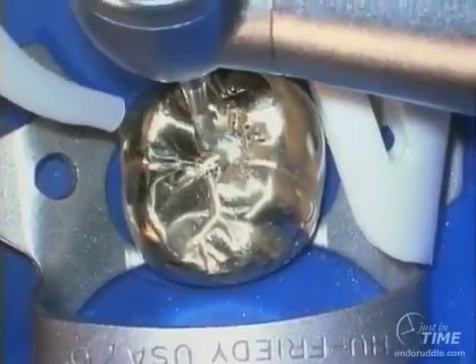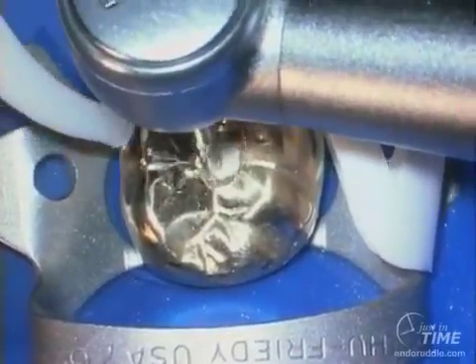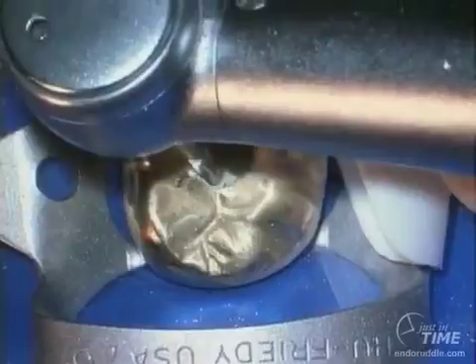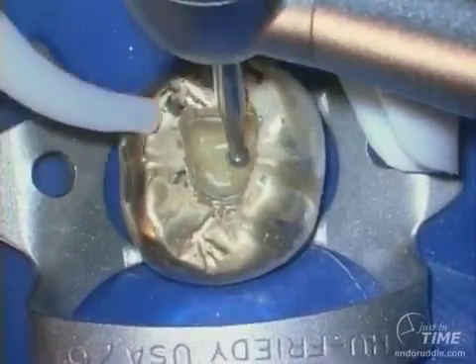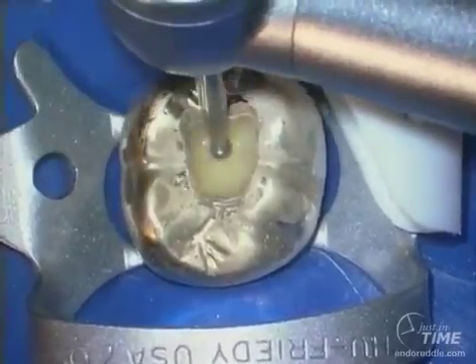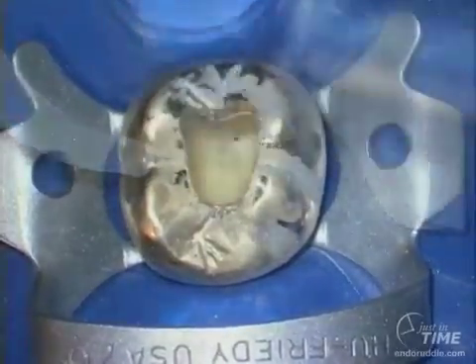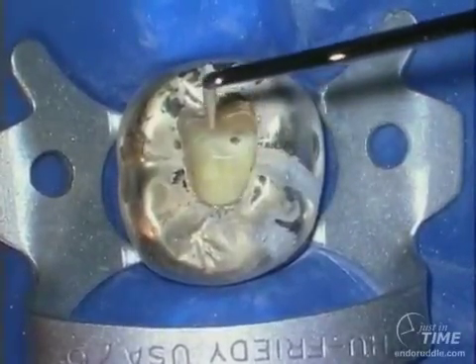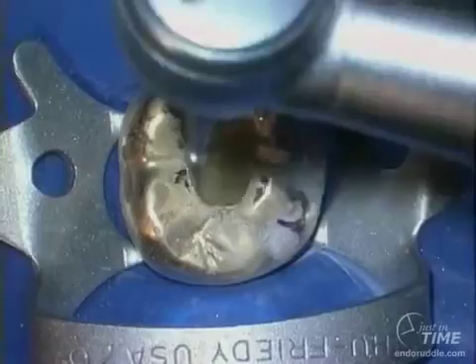Be sure to have a good finger hold because sometimes these burrs like to skip or skate when you have a metal burr on a metal restorative. You can then expand the access mesially and begin to get prepared to use surgical length instruments. A surgical length number four round burr allows us to brush in a mesial-distal direction. The assistant can blow air through the stropco to evacuate dust up the high-speed suction. We work progressively mesial and distal until we uncover a little bit of the pulpal chamber. Notice the access pattern — it's incomplete but expanding, and it will be finalized once we find the pulpal floor and the related orifices.